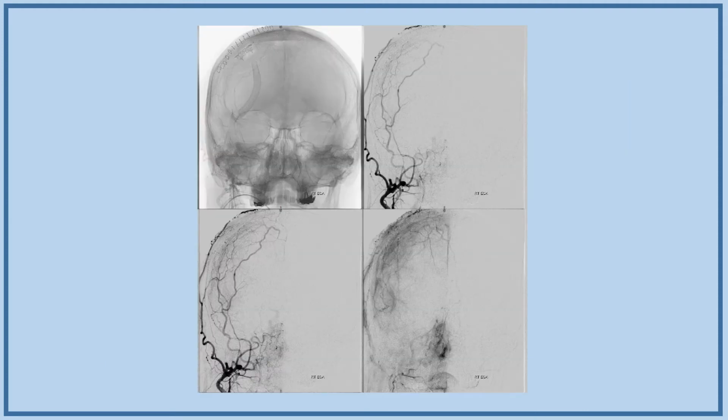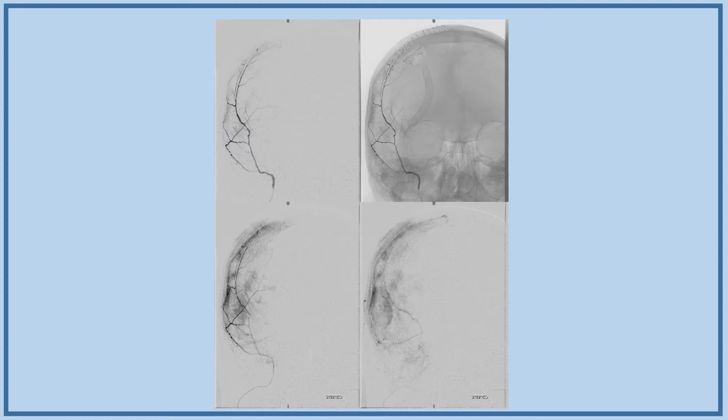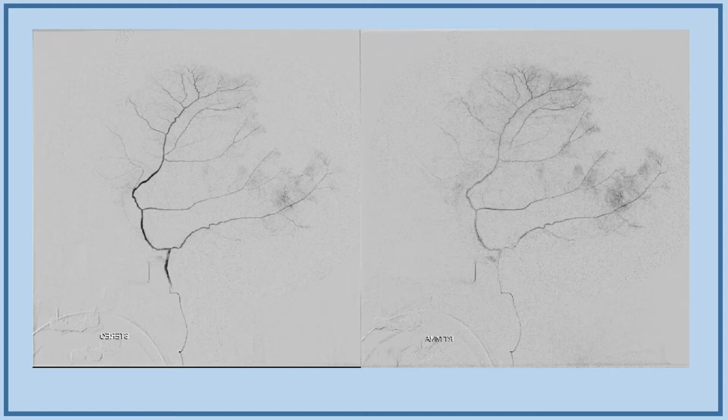There's the ECA, and here's the lateral of the ECA. We'll come back to that picture a bit later. So, standard thing, microcatheter in the MMA. You get a picture. Look at this beautiful membrane enhancement, all of this hyperemia of the membranes. You see that most often like this. Very nice example. That's a cross-eye stereo, for those of you that like this kind of thing.